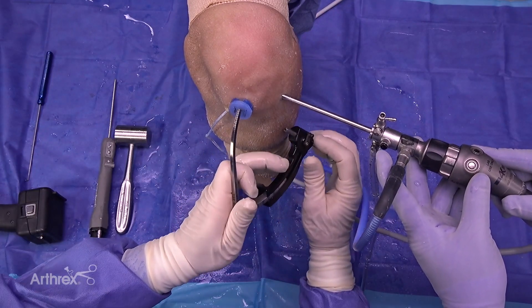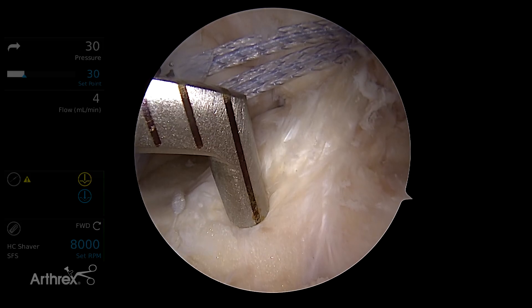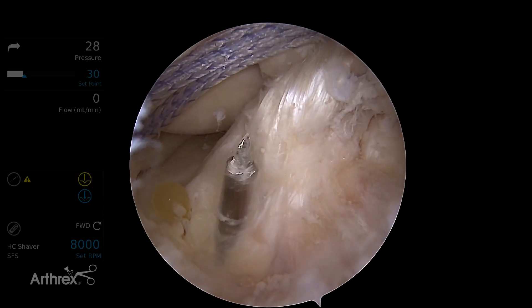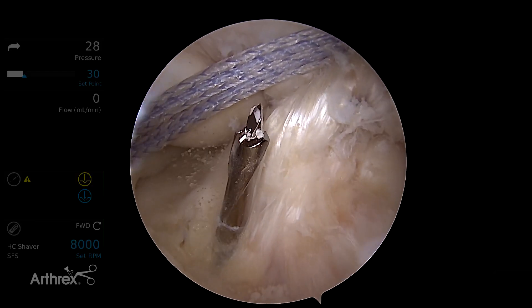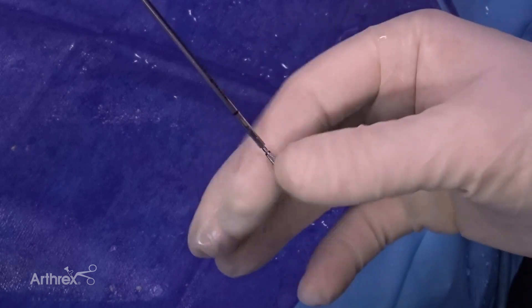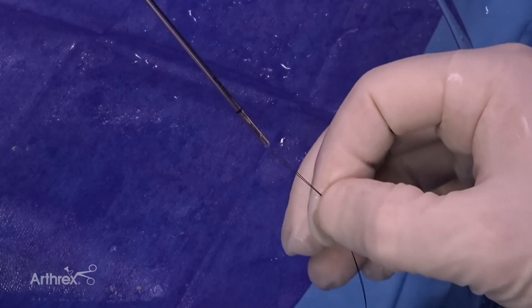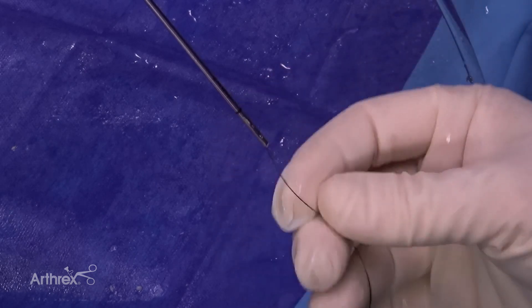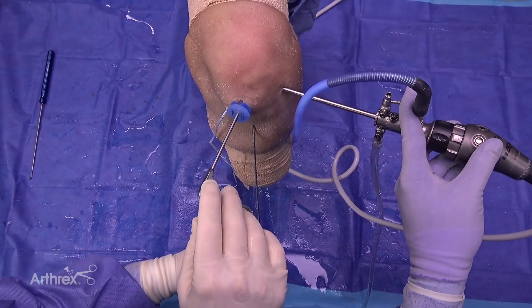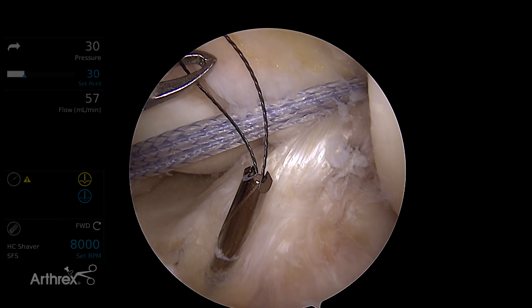Next we're going to pass that fiber tape distally. We want to get into the anterior third of the ligament, and usually I'm centered on the anterior third of the footprint. Now we're going to drill up through that anterior third of the footprint. This is the cannulated 2.4 drill — we take the knurled end, undo the cannulation, and pass our nitinol wire right up through the same drill, so you don't lose your hole. The hardest part of the whole case sometimes is threading the nitinol wire up the tail end of that 2.4 drill pin. We chose the 2.4 cannulated drill to minimize the amount of bone we take and conserve as much anatomy as we can.